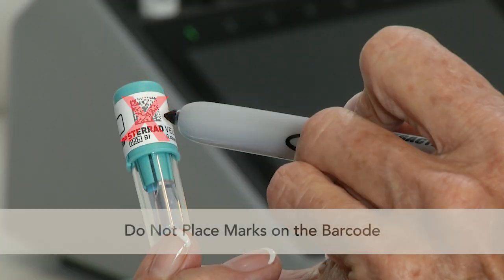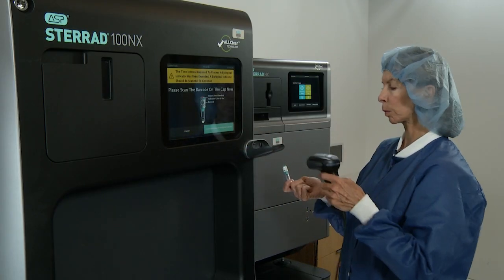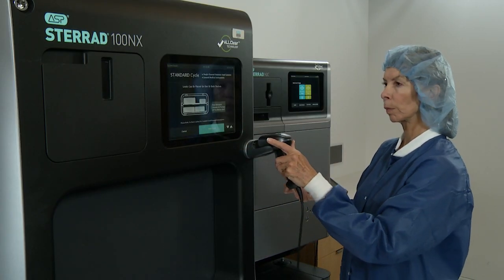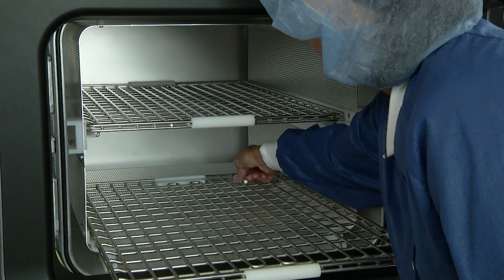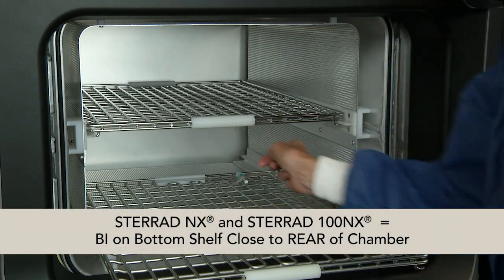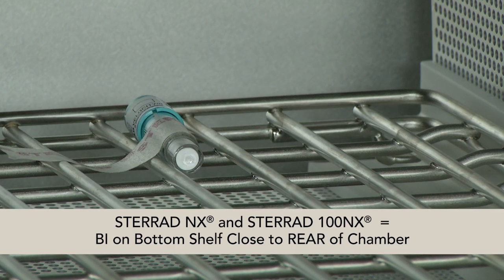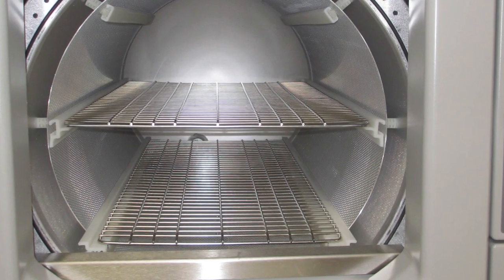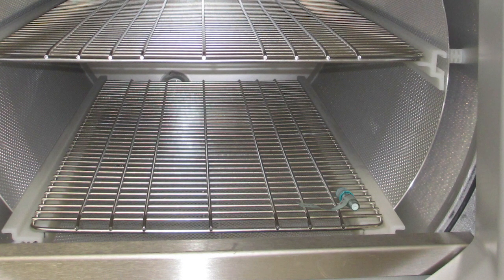Additionally, do not place marks on the barcode, as this may interfere with a barcode reader's ability to retrieve barcode data. If the STERAD sterilizer is equipped with a scanner, scan the barcode on the cap label. When using the STERAD NX or the STERAD 100 NX, place the BI on the bottom shelf close to the rear of the sterilization chamber. When using the STERAD 100S, place the indicator in the bottom close to the front of the sterilization chamber.